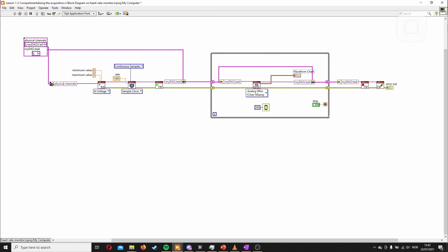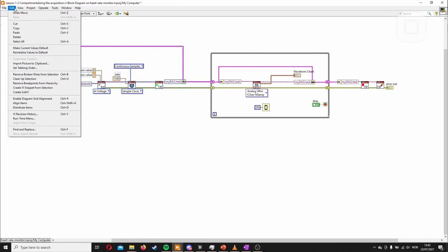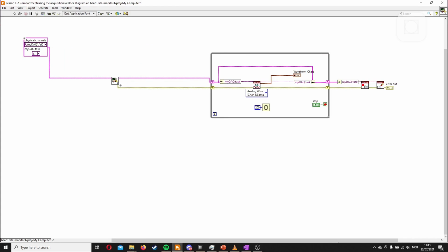And we can start with this one. What we want is we just want this cluster to be the input and the output of the VI, so we'll just mark everything we want inside and not anything more. And to create a sub-VI, you go into Edit, Create Sub-VI, and there you go.